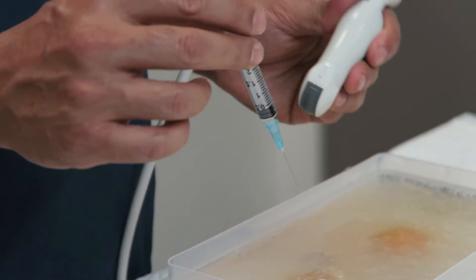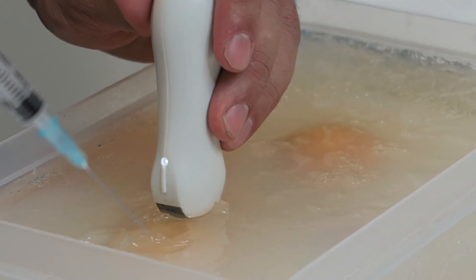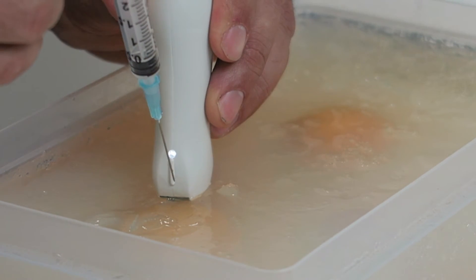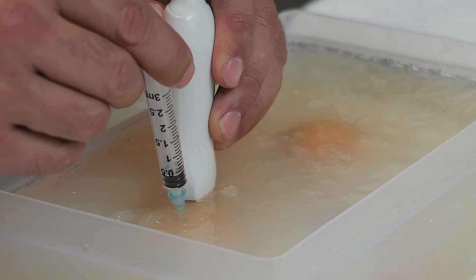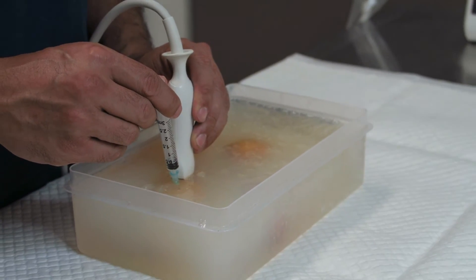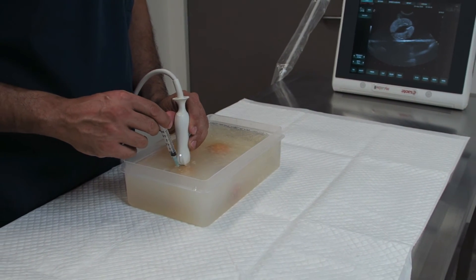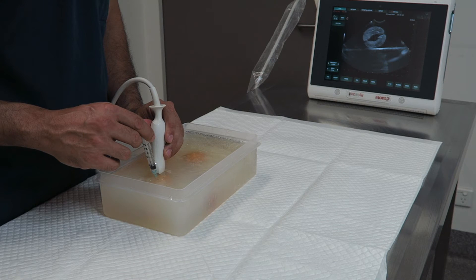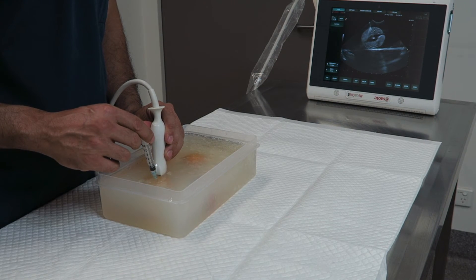Let me demonstrate on the ultrasound. We've located the area of interest. We insert our needle and we can't find it. So instead of moving the needle, what we do is we move the probe to locate the needle.